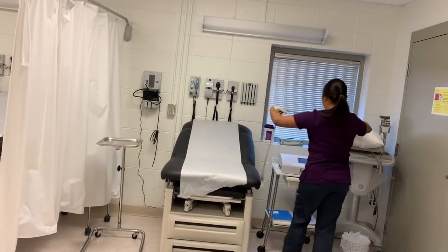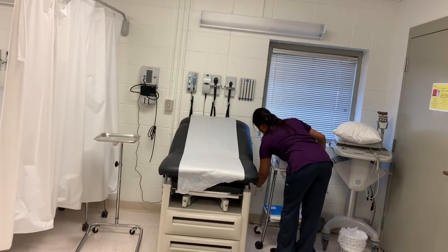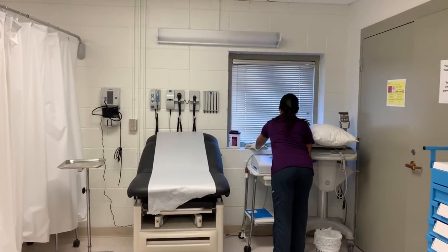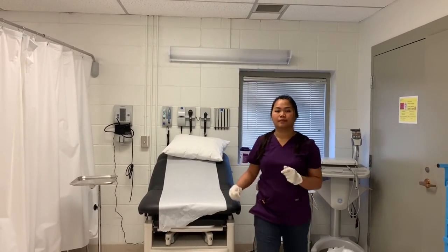Make sure that you drape them nicely and put them in the area where they belong. And now I'm finished.